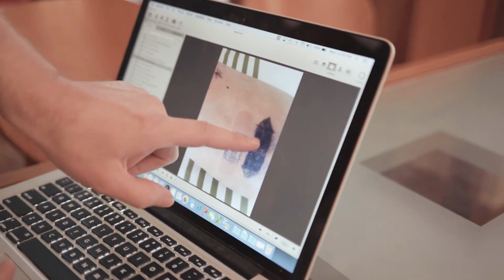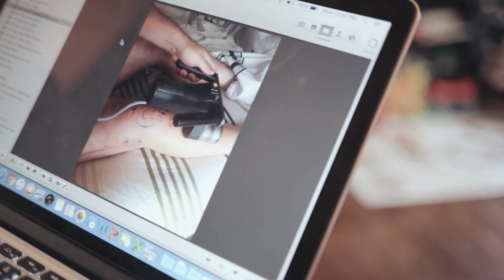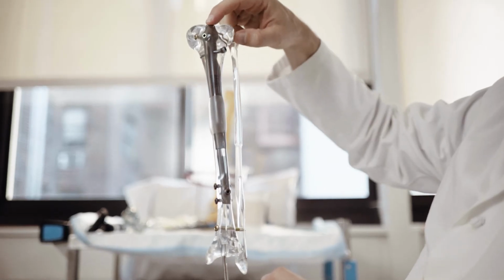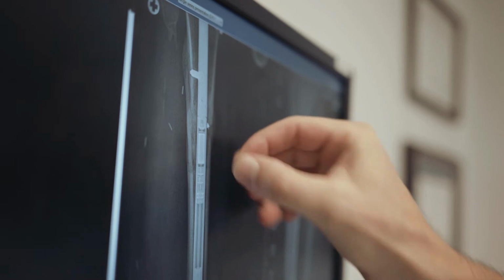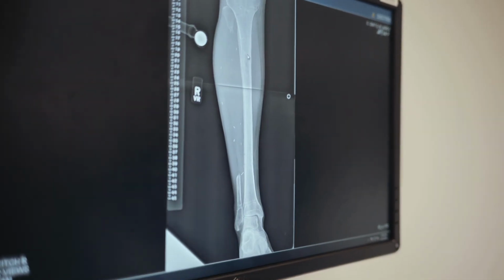He drew with a Sharpie marker on my leg where the controller has to go. You slide it up and down a little bit, you can feel where the magnet kind of like engages with the nail underneath there. And they push a button, the remote control device rotates the magnet, and that is what distracts the mechanism. And you did that 4 times a day, in my case. And then after like 6 weeks or so, the length was right. We got him 2 inches of bone length in his tibia using the PRECICE internal nail.